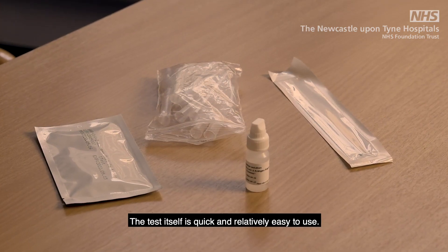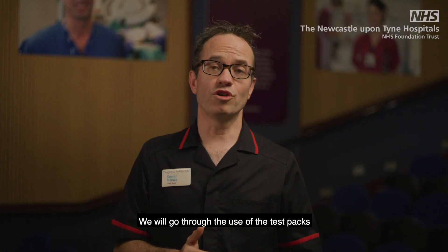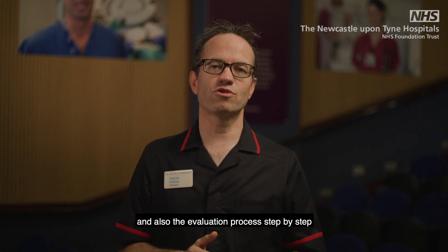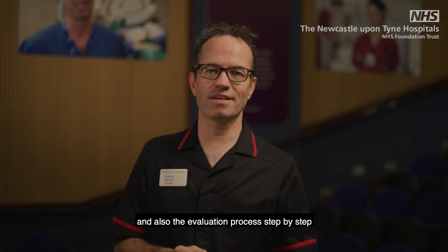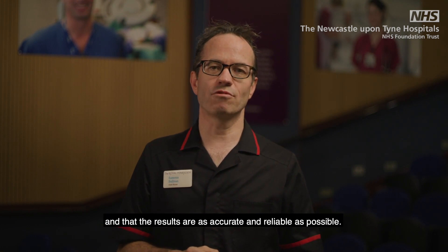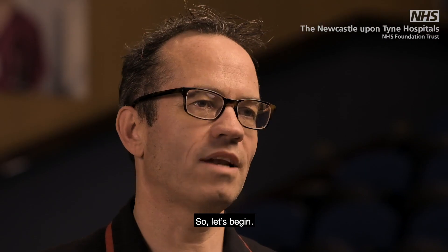The test itself is quick and relatively easy to use. We will go through the use of the test packs, instructions for individual tests, and also the evaluation process step by step to make sure the tests are done correctly and that the results are as accurate and reliable as possible. So let's begin.